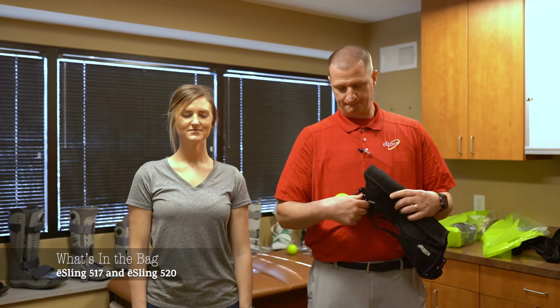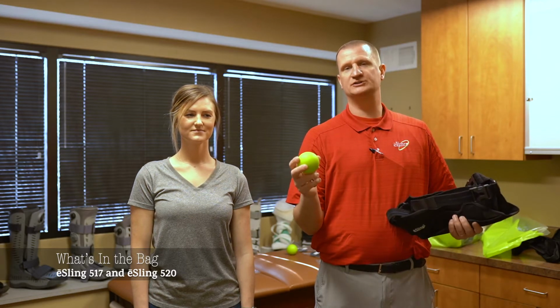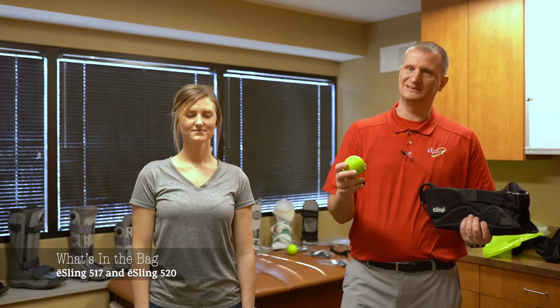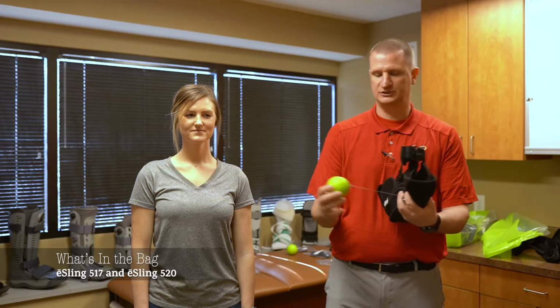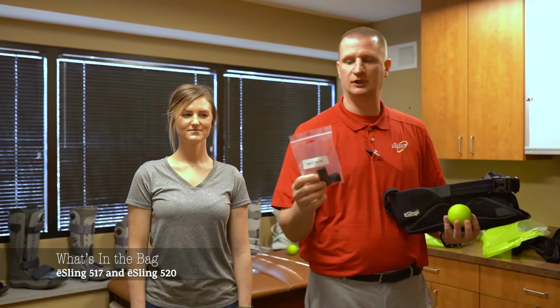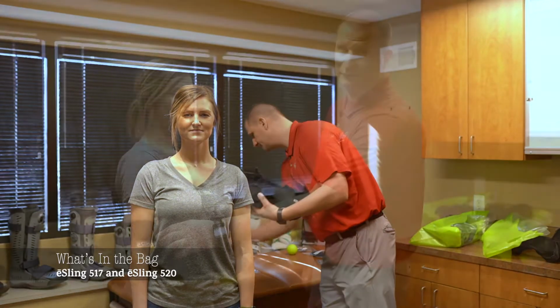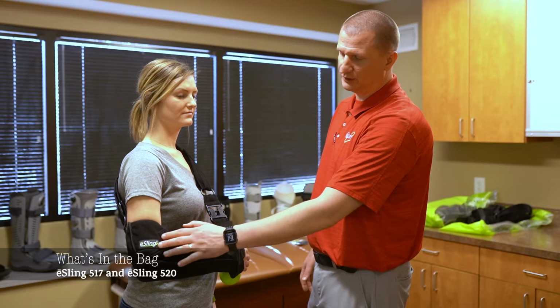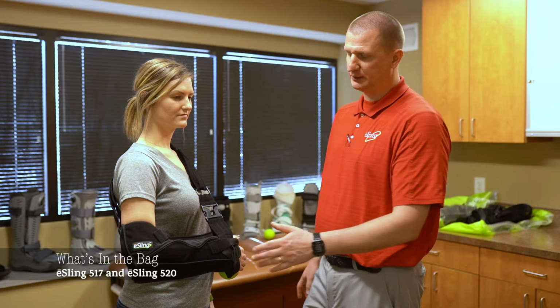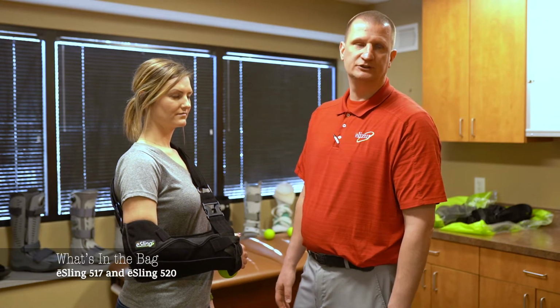You'll also get a ball on a reel for any home exercise program, etc. If the patient doesn't like the ball on the reel, which is this reel here, it also can be put into a cage which will Velcro onto the front of the sling. These are all accessories with the sling. If it's being fitted in the ER and is not put on initially, please do not throw that accessory away. This needs to be utilized by the patient later during their recovery process, so we want to make sure that those patients have access to it.